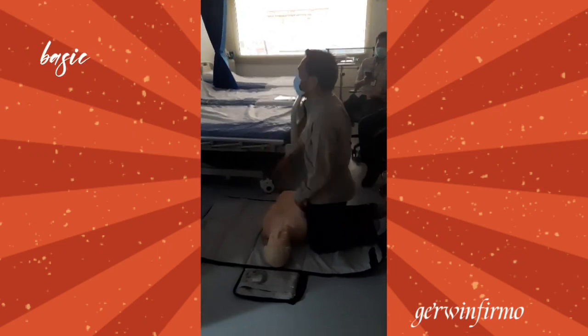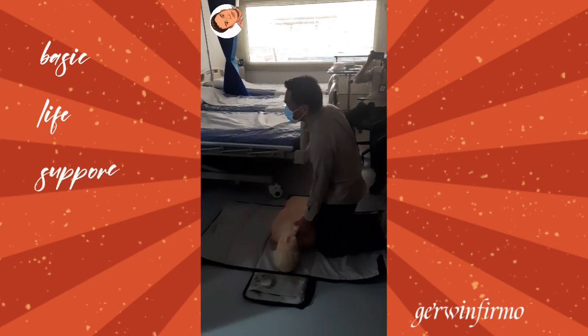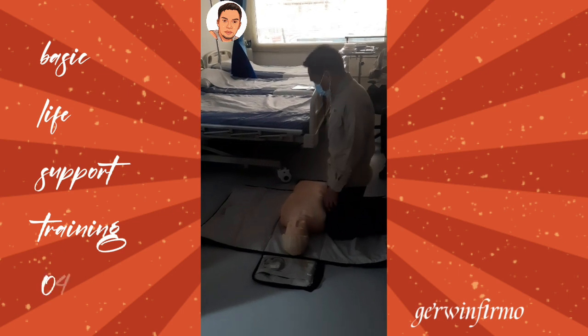Are you okay? Are you okay? Hey! Help! Someone help! Activate the emergency response and get an AED. Give me the AED.